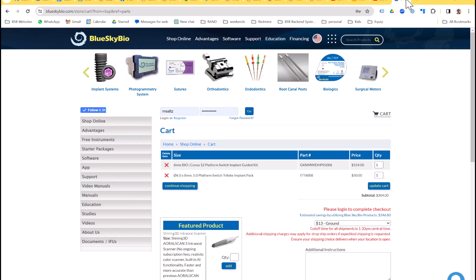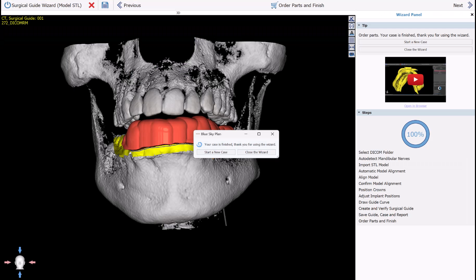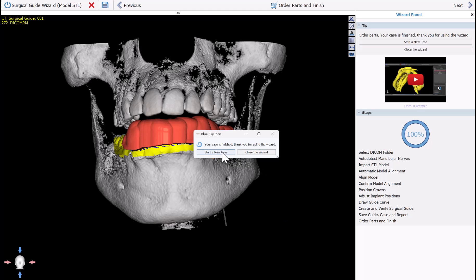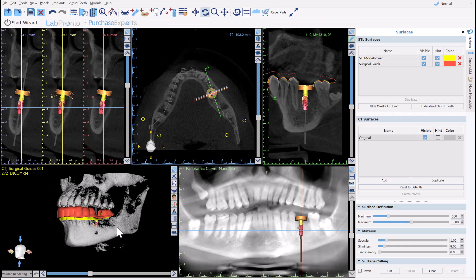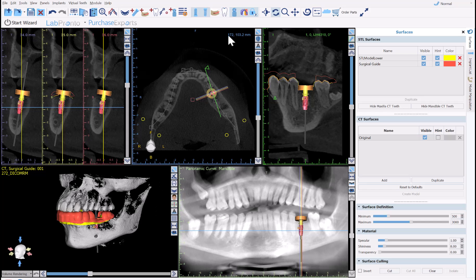Moving on, the Blue Sky Bio website will open for Blue Sky Bio implant cases, showing relevant information regarding the implants and abutments being offered. If you have the relevant parts, simply close the website and switch back to the software. You now have the option to start a new case or close the wizard. I'm going to click Close the Wizard — we have completed the wizard process flow.